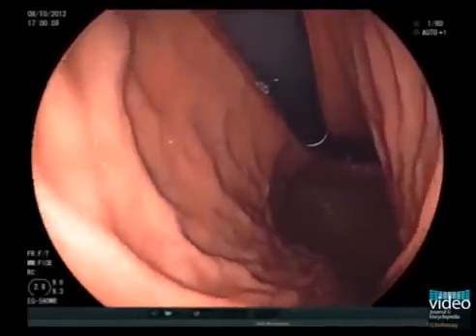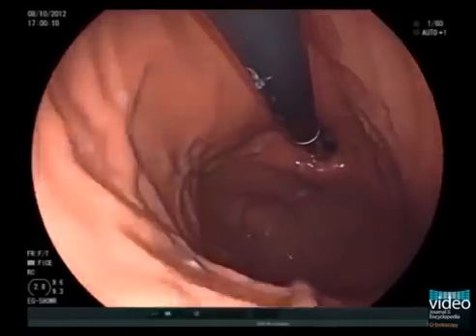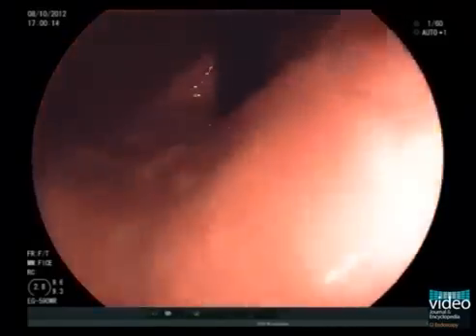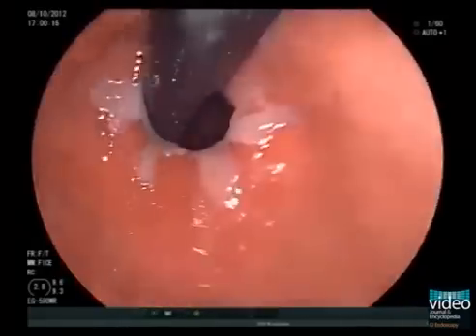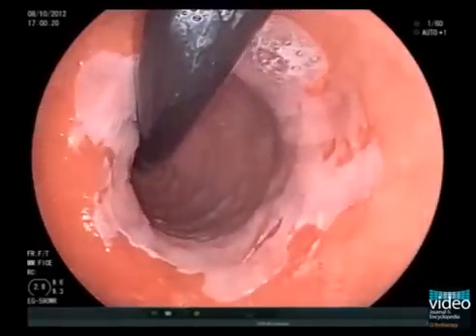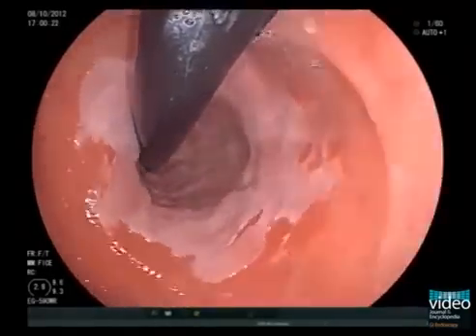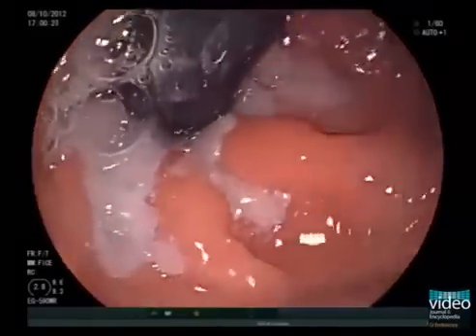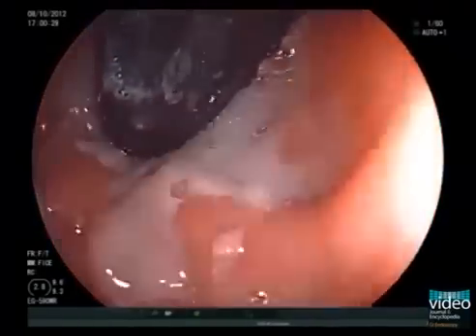Now withdraw the instrument in the retroflexed position for a short distance while maintaining continuous air insufflation. We pull the tip of the endoscope inside this hernia and perform a 360-degree rotation, both clockwise and counterclockwise, to complete the retroflexed view. This maneuver allows close inspection of the short Barrett segment.